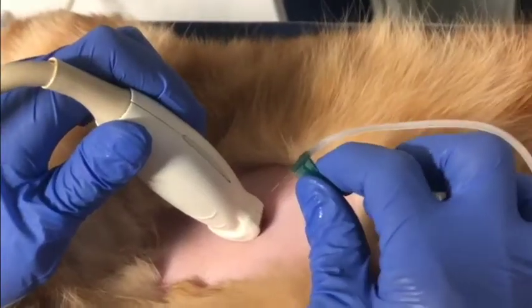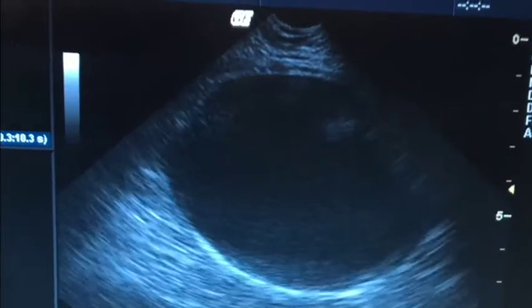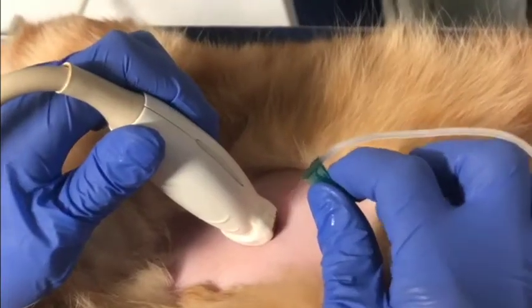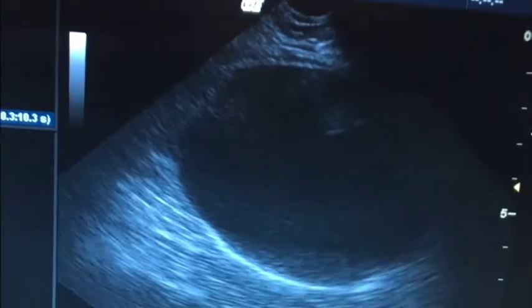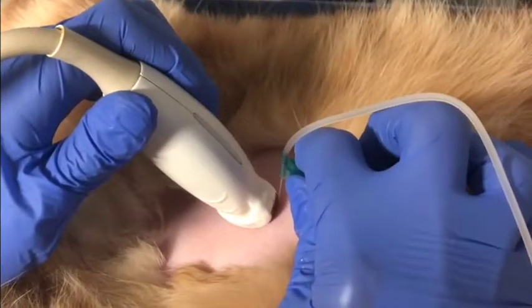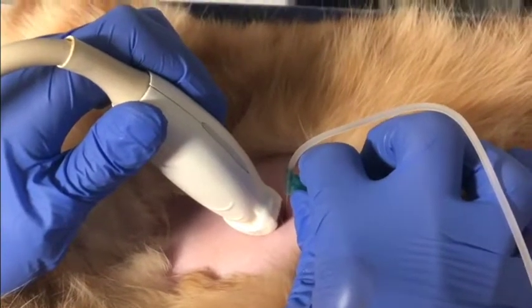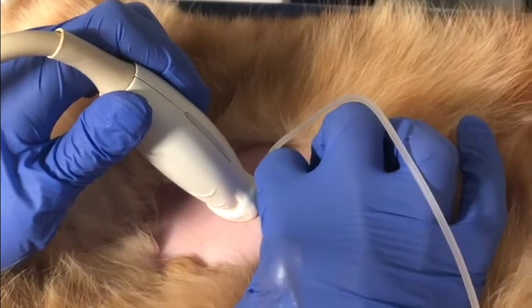For decompressive cystocentesis, which is most often used in the blocked cat to alleviate the pressure within a maximally distended bladder, I prefer either a butterfly catheter or an extension set so that the setup is a little bit less rigid. It is important to not advance too forcefully or quickly because that can lead to urinary bladder rupture.